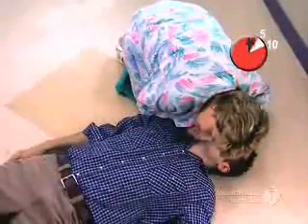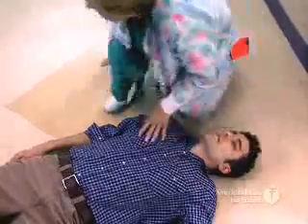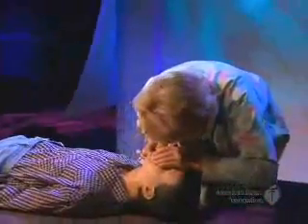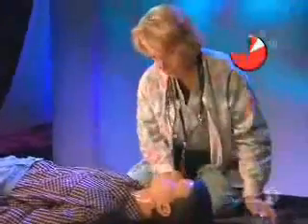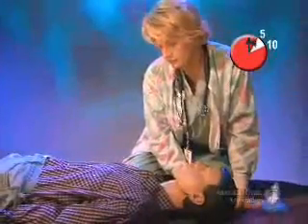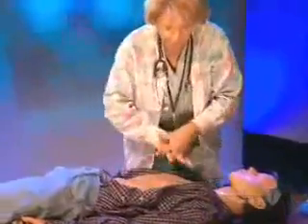Check to see if the person is breathing adequately. If the victim isn't breathing adequately, give two breaths with a barrier device. Check for a pulse, and if you do not definitely feel one within 5 to 10 seconds, quickly move or remove the clothes from the front of the chest that will get in the way of providing chest compressions and apply the AED pads.